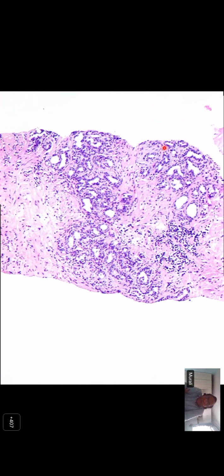And more, they're still in a family. They all look like they are in a family, and there are no glands which are running away from the family. There are no orphan-looking glands. They're still in a kind of big lobular architecture, although you cannot comment on a lobular pattern architecture on a biopsy in many cases. But like sir said, the blue-looking pattern, the presence of inflammation in these foci, which is very uncommon in prostate cancer, should make you think, is it atrophy?